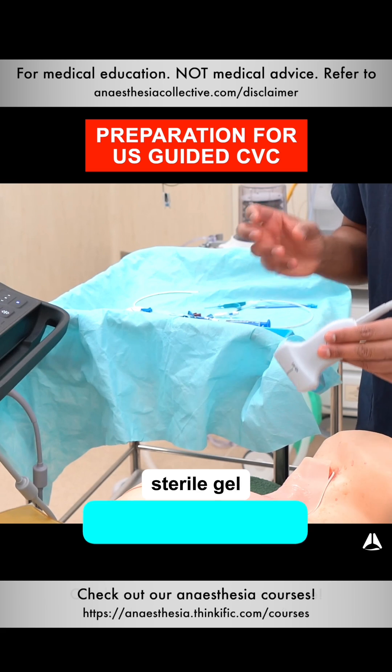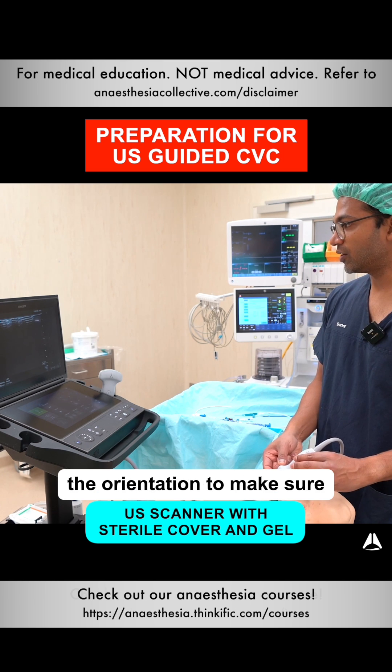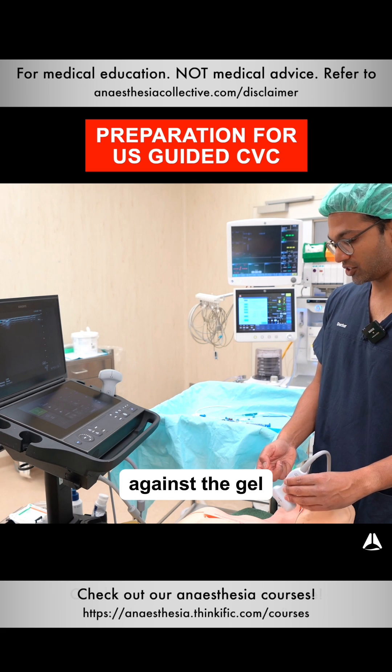The ultrasound should also have sterile gel and a sterile cover. When I first put the ultrasound on, I first check the orientation to make sure that I'm looking at it the right way, and I just use my finger against the gel there.